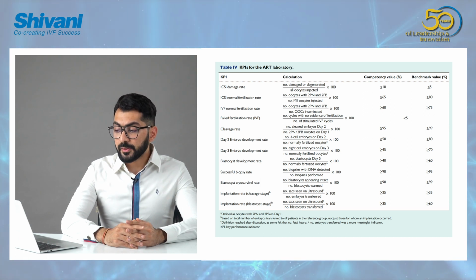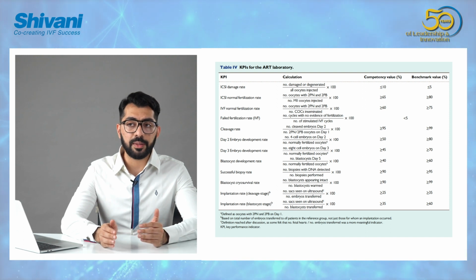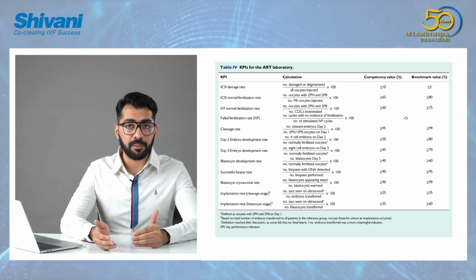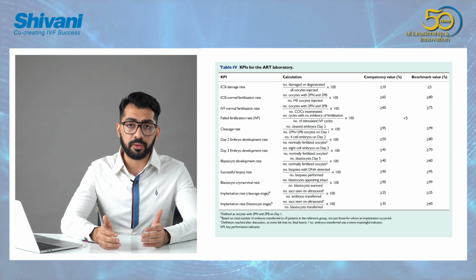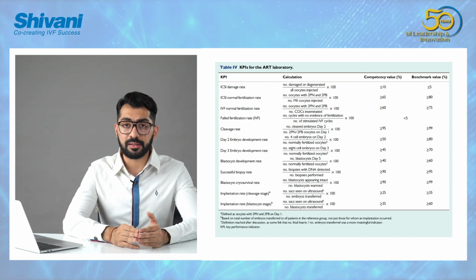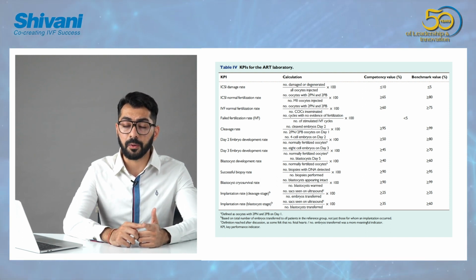Now, what happens when this rate falls? Firstly, we have to understand that slow growing embryos might not be the best for your patients. They might still develop to blastocysts, but they might not give us the best quality results. The first thing, and probably the most important thing that we want to assess here, is whether those 3 important cardinal parameters that I spoke to you about, temperature, pH and osmolality, are disturbed or not.